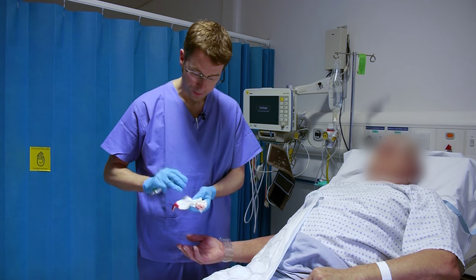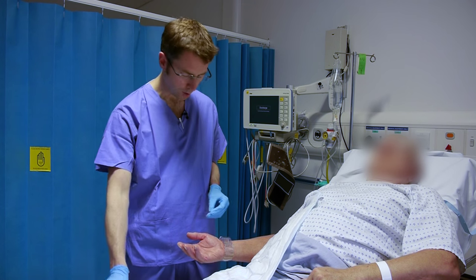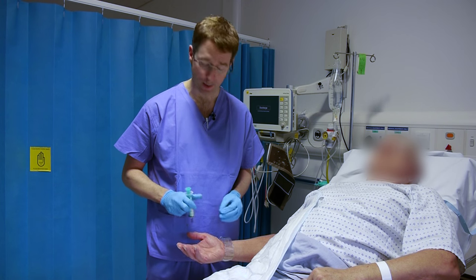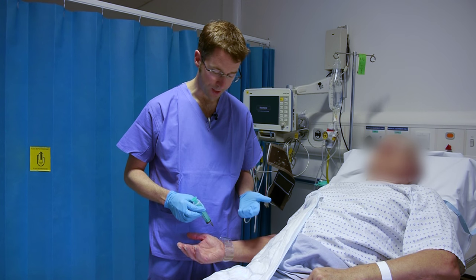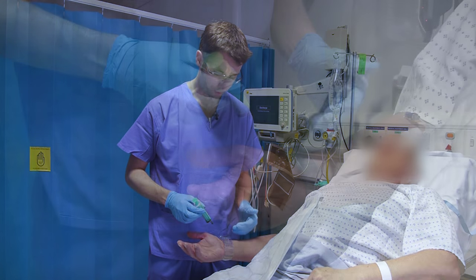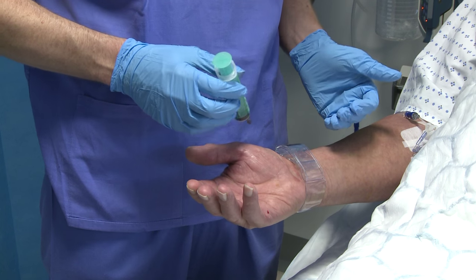At this point we would transfer the patient back to the day case area. Once we arrive there, what we want to be achieving is true patent haemostasis. The idea being that we have circulation from the ulna, but then obviously that we reopen the radial to try and minimise the chance of acute occlusion.